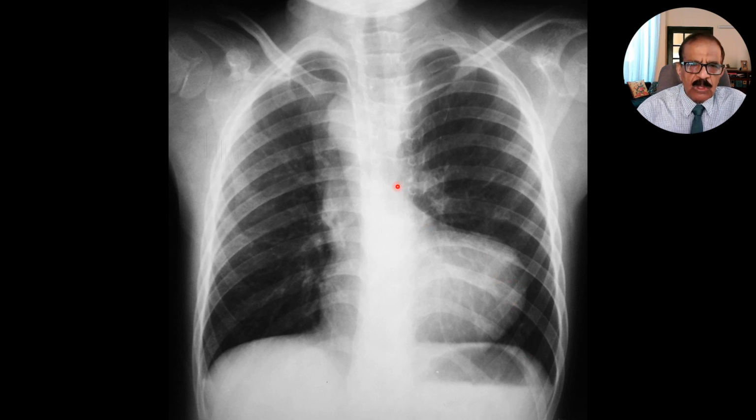Number two, the normal concavity in the upper part of the left cardiac border is more pronounced. It is more concave than normal, as if the structures normally present here, the pulmonary artery and left atrium, are smaller. Maybe they are smaller in some condition. And the third finding is the prominent right cardiac border.